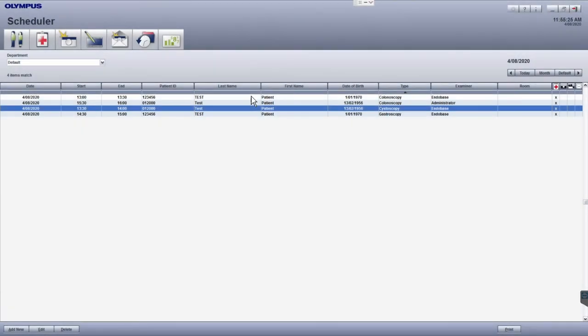As you might know, the scheduler is the home screen of EndoBase which shows the list of examinations and allows you to select the right patient for documentation.